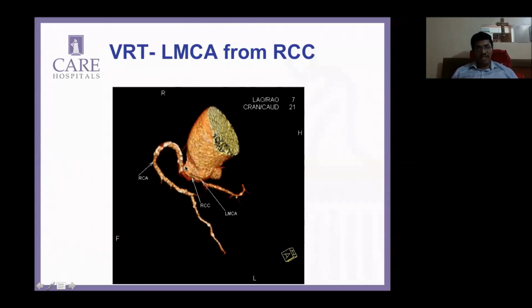If the RCA comes a little higher up, then the muscular pulmonary artery would compress it in systole. Whereas if it comes a little lower down, at the fibrous point, then the compression is less. And many of these patients also didn't have high-risk features like you described. A slit-like orifice was not there, and acute angulation was not there in this particular group.